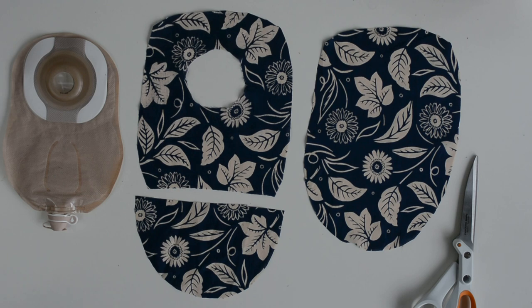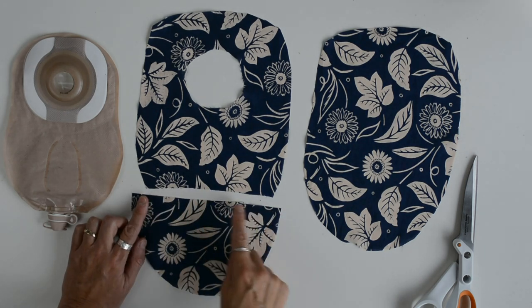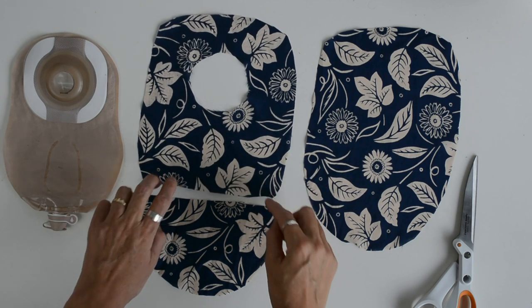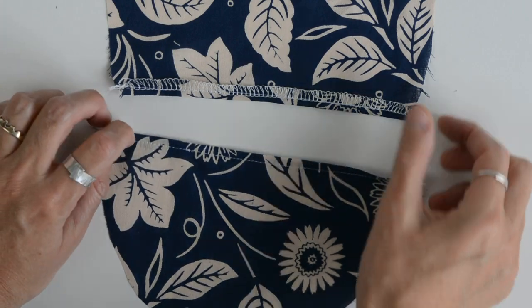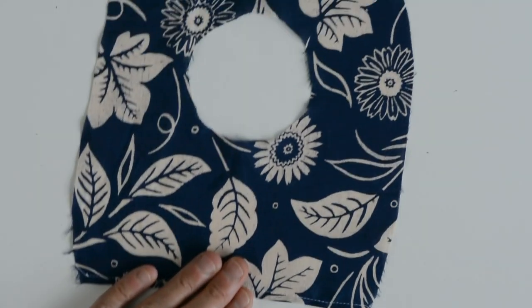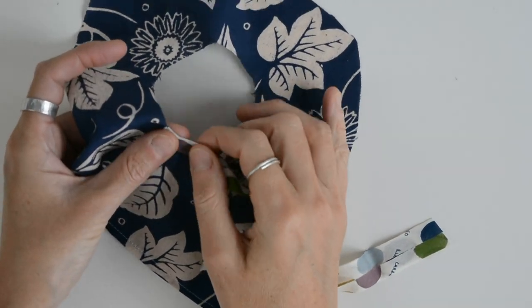So here you have your three completed pattern pieces - the front, and the back with an overlapping flap. The first thing we're going to do is zigzag or overlock these two edges, then turn them over and top stitch them down to give a nice neat edge. This is the wrong side, this is the front side - overlocked, pressed and top stitched. The next step is to put bias binding around our circle to neaten this raw edge. Let's pin our bias binding - I'm going to fold it in half over the raw edge and pin around.